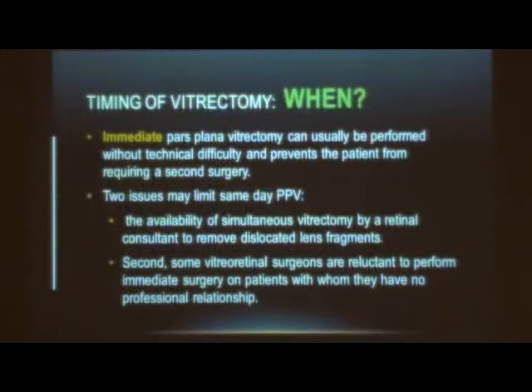So immediate post-op vitrectomy can usually be performed without technical difficulty and prevents the patient from requiring a second surgery. And as Dr. Asaf said, the patient is finished and he goes home without knowing that he had a complication. But two issues may limit the same day vitrectomy. First, the availability of a simultaneous vitrectomy by a retinal consultant to remove dislocated lens fragments. You have a retinal consultant working in the room beside you. If you don't have this, this will be a difficulty.